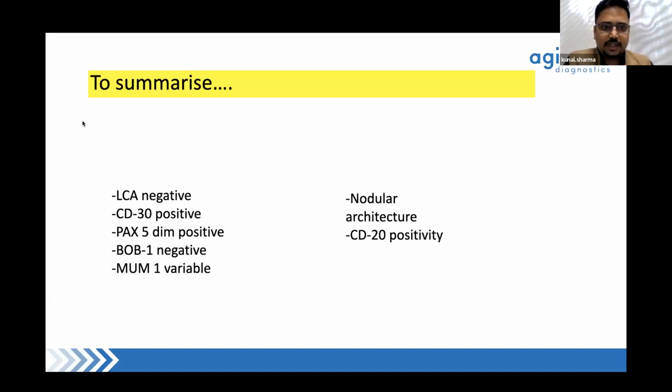With that, I would like to proceed to the second case. It's a case of a 24-year-old female, and this is a very interesting bladder mass biopsy. Dr. Nupur will be presenting this case. Dr. Nupur, over to you.